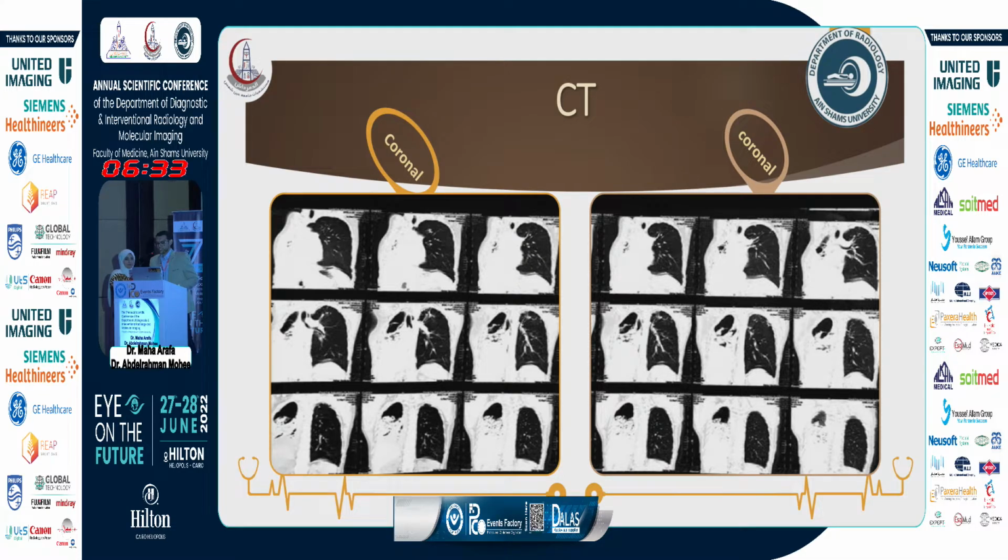On reviewing the patient's CT, it showed multiple bronchiectatic cavities, mainly affecting the right lung, as well as multiple mediastinal and periaortic hypertrophied bronchial arteries with no evidence of ectopic ones. So our team's decision was to intervene, as the patient wouldn't survive another attack of hemoptysis.